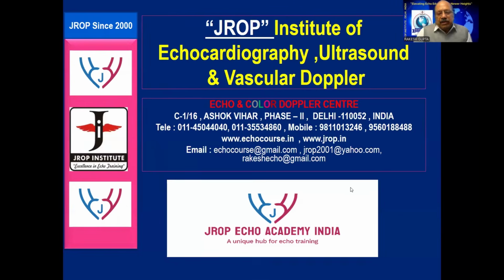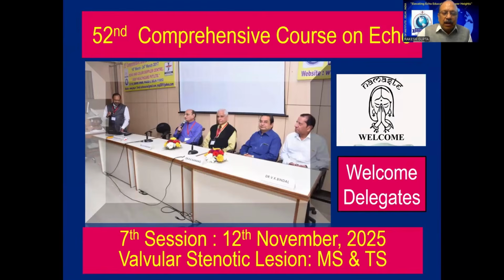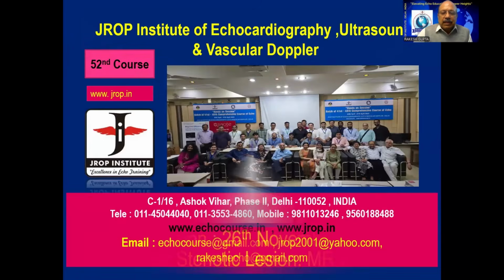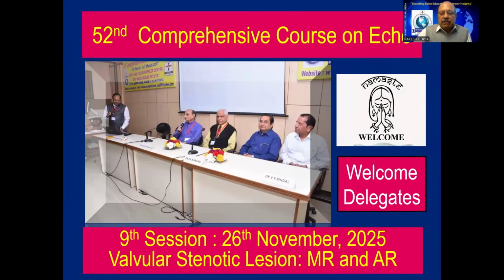We have come a long way after learning from the basics of M-mode, 2D, and Doppler. We started with valvular lesions. In the valvular lesions, what we have done till now, we have looked at all the stenoses: mitral stenosis, aortic stenosis, tricuspid stenosis, and pulmonic stenosis. Now we are moving on to the next session, that is mitral regurgitation and aortic valve regurgitation. They are again applications of the technology which we learned with the basics of echocardiography.